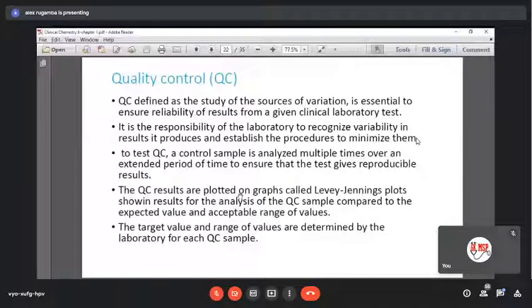It's called negative control when, for example, blood sugar varies between 70 to 110. So you have a negative control, it means that you have a control which gives the result of 70 milligram per deciliter. And you have another one which gives the result of 110 milligram per deciliter. So when you are measuring before starting the work, you know that my control will give 70. You measure and it gives you 70, and then you write it somewhere. Today is the 5th November. On the 5th November, I measured the control, it gave me 70, negative control. And then the positive control gave me 110.